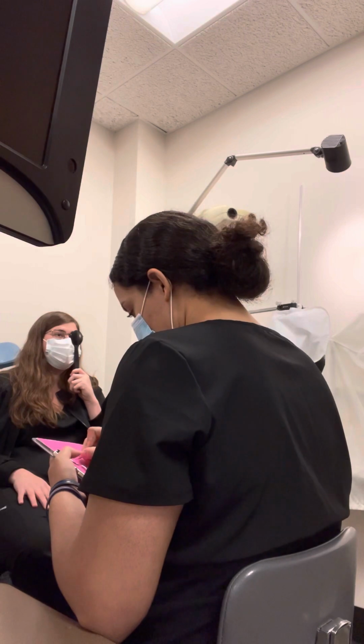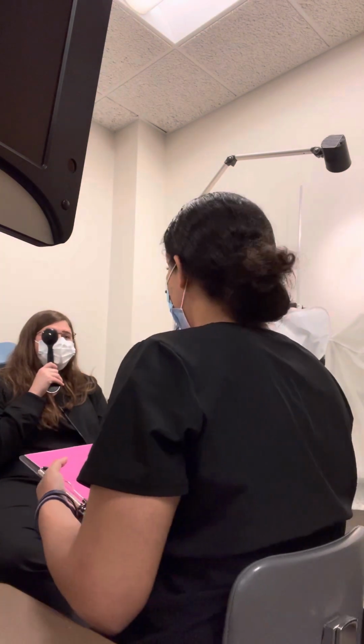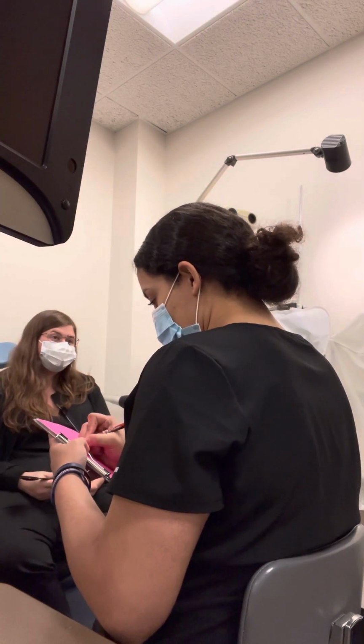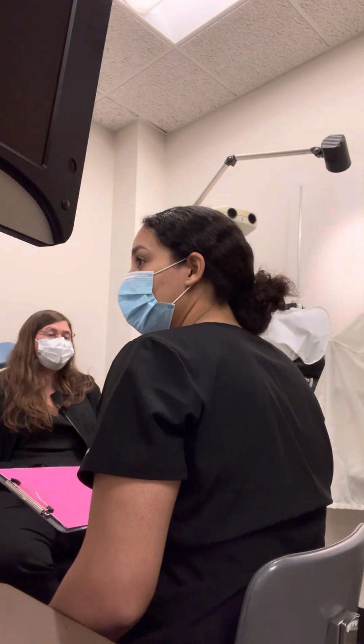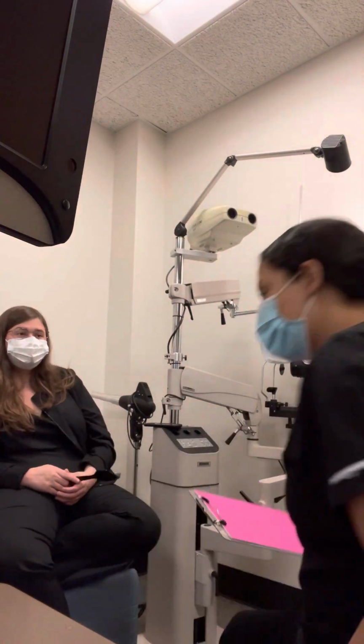TZVECL. Okay, thank you. Go ahead and cover up your right eye for me. What's the lowest line you can read without squinting? OHPNTZ. Awesome, thank you. And with both your eyes, without squinting, what is the lowest line you can read for me? OHPNTZ. Awesome, thank you.